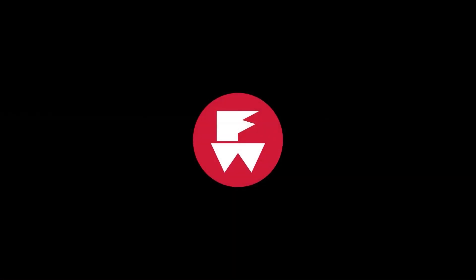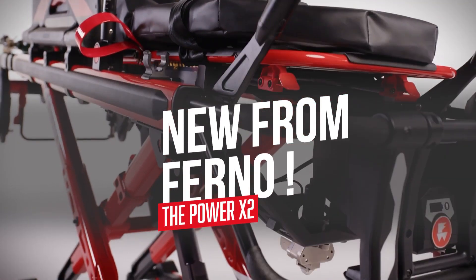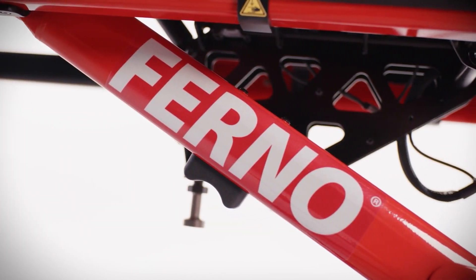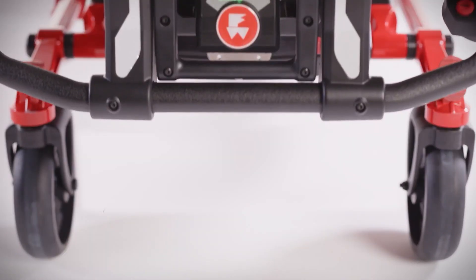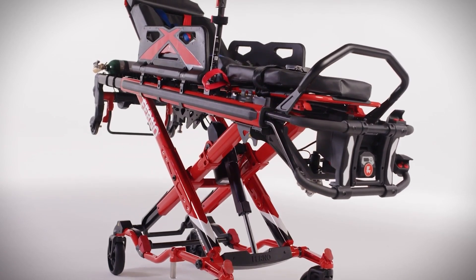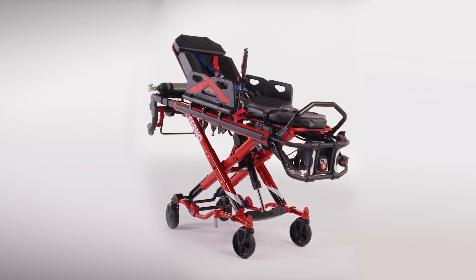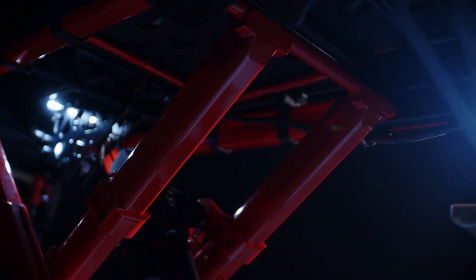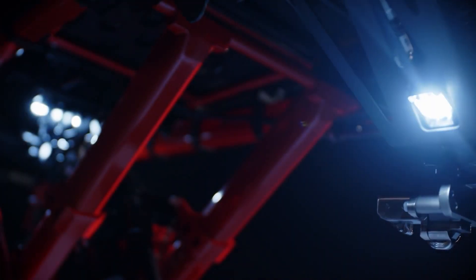The newest addition to the Ferno line is the Power X2. Key new features over the Power X1 include 27% larger wheels with increased ground clearance for better maneuverability over rough terrain. The Cross-Lock system is universally cross-compatible with the majority of manual and power load systems on the market — a huge feature. It also features a 36-volt lithium-ion Endura Charge battery that lasts two times longer than competitors.